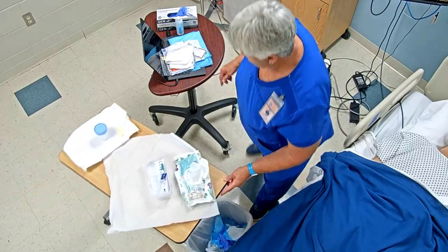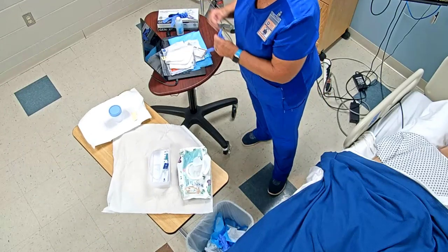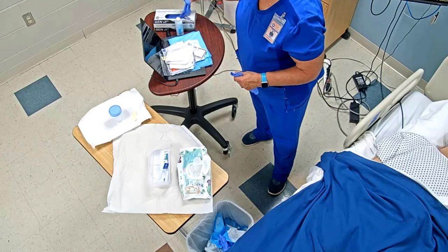And now I need to get my specimen. So I'll go ahead and get my gloves on.